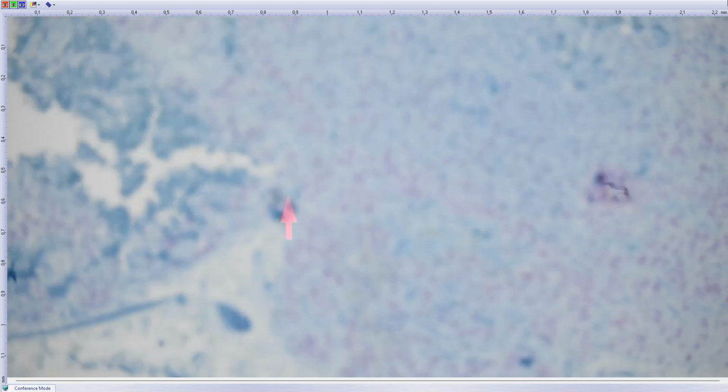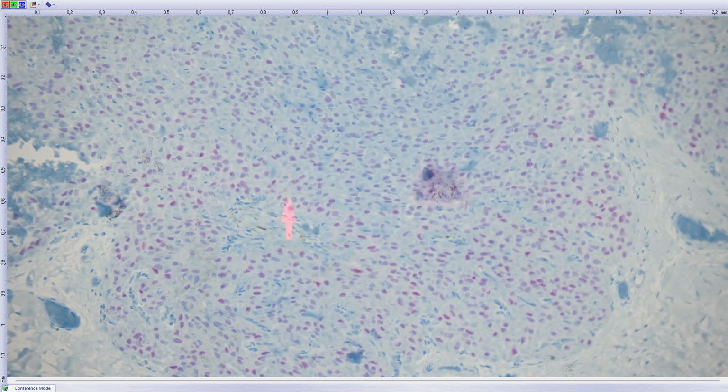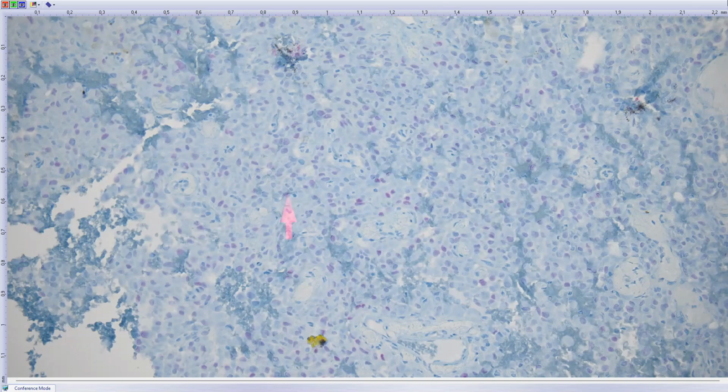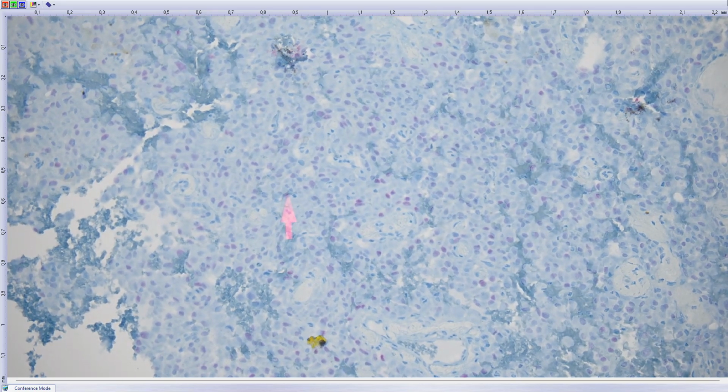But what was nicely seen here was PLAG1 immunopositivity. So I think it is one of those PLAG1-fused hyalinizing clear cell tumors of salivary glands. Actually, we should get more cases of it, yeah? By quick looking in 12 files, I found 2 cases. Another one is this one.